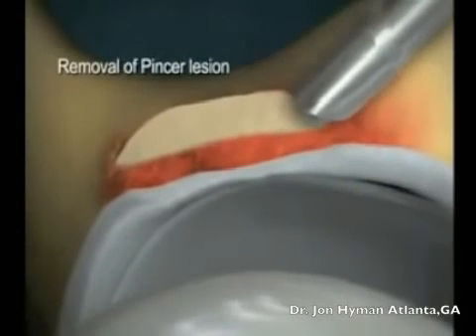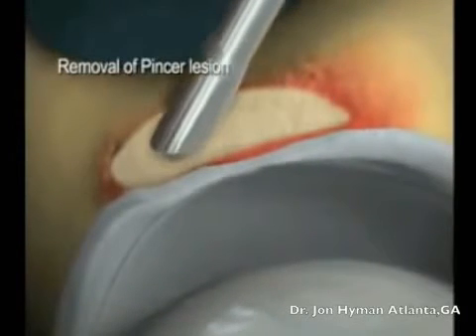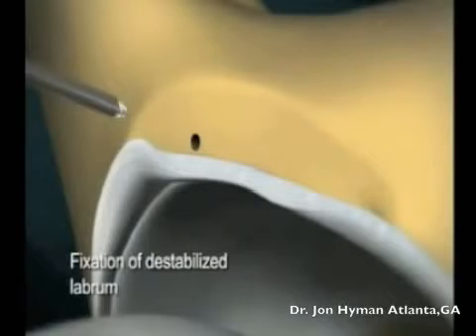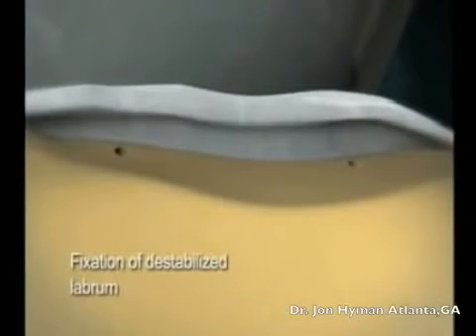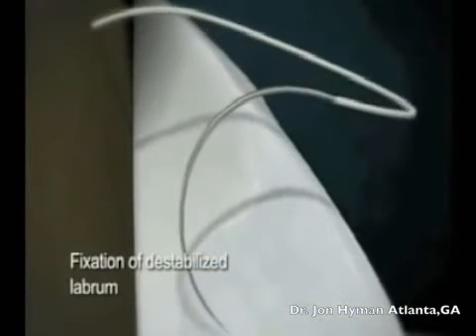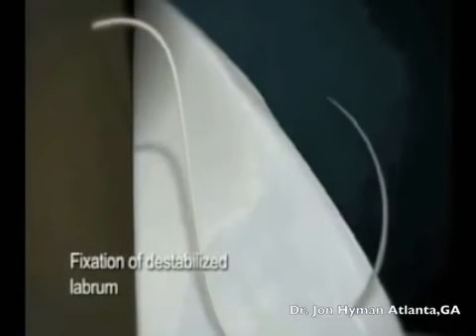Intraoperative fluoroscopy is often used to assist in determining the extent of bony resection. Once the rim impingement lesion is removed, the viable labral tissue is refixed to the rim of the acetabulum. Suture anchors are placed in the rim of the acetabulum. Once the anchors are placed, the suture material is passed from the base to the tip of the labrum. This helps to avoid exposing the suture to the cartilage of the joint.